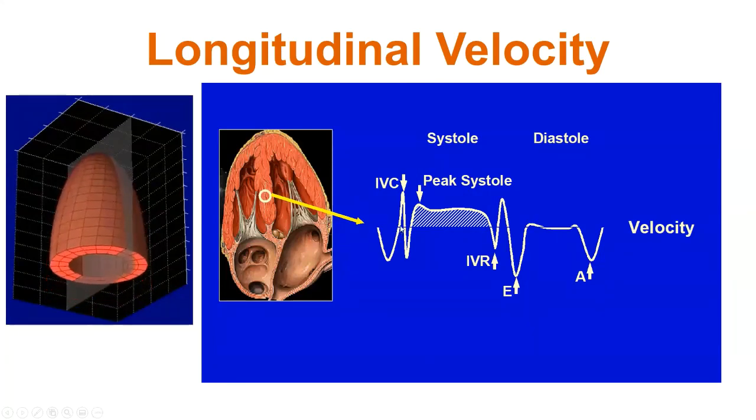And I would keep in mind what the waves of tissue Doppler, which measures the velocity of myocardial movement, look like. So during ventricular systole, you have an isovolumic signal, kind of an up and down signal, as you see here. This is the ejection phase of systole and what it looks like on tissue Doppler.